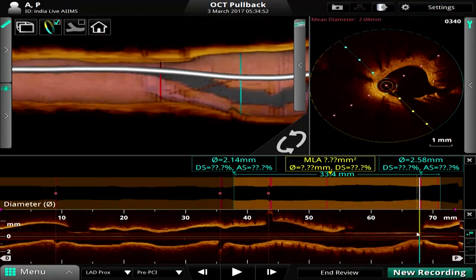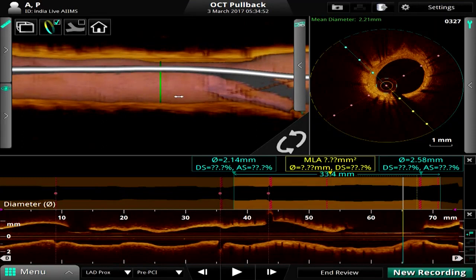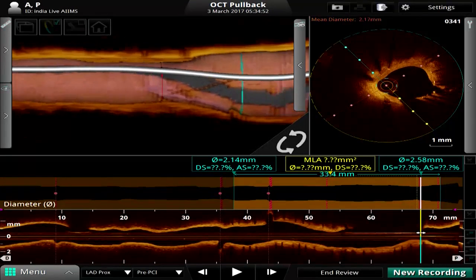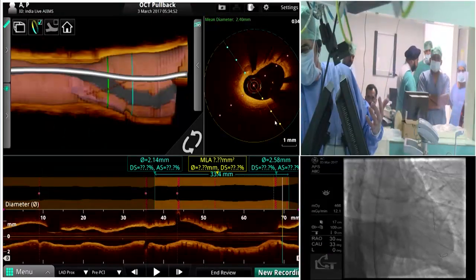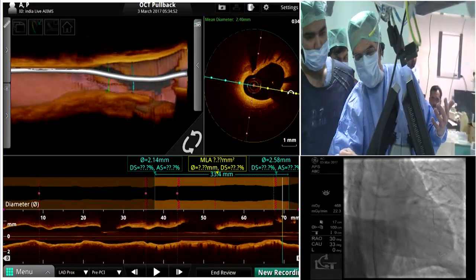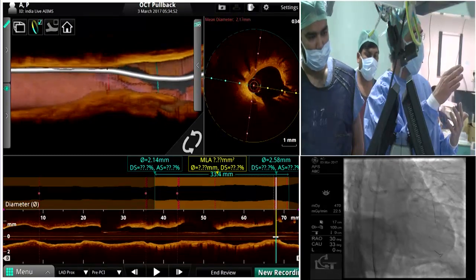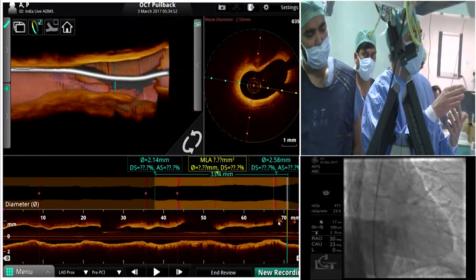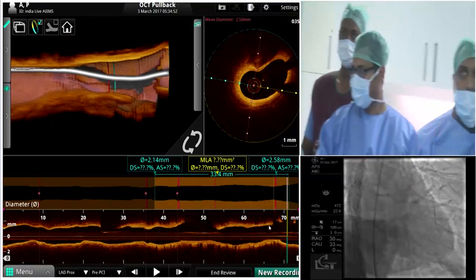It's not like at the implant, when you can see the structure, because they are covered by the tissue. What we can see, even in the longitudinal view, is where the wire is coming through. You can see it immediately before 70. So is it a good place for the wire to cross, or should we recross it?